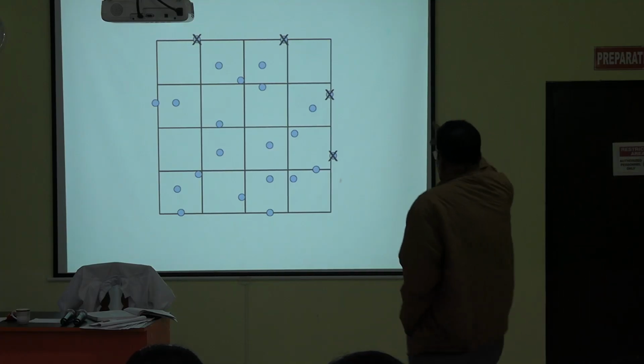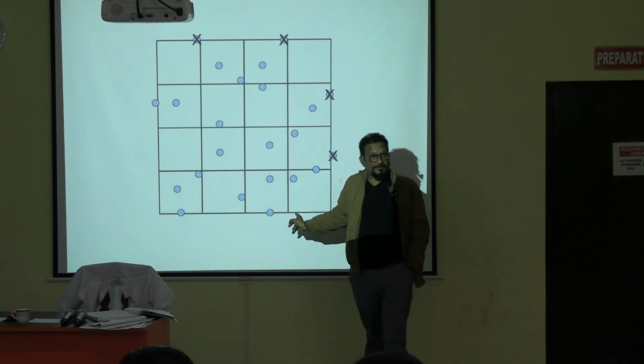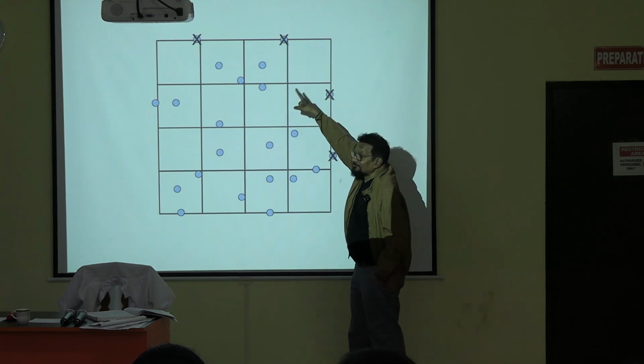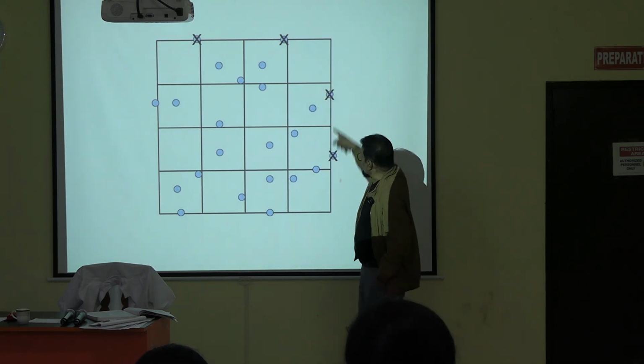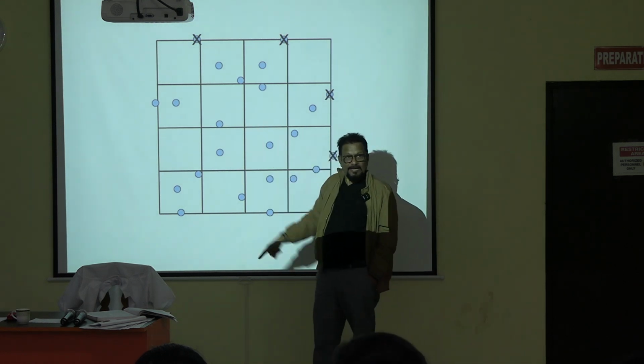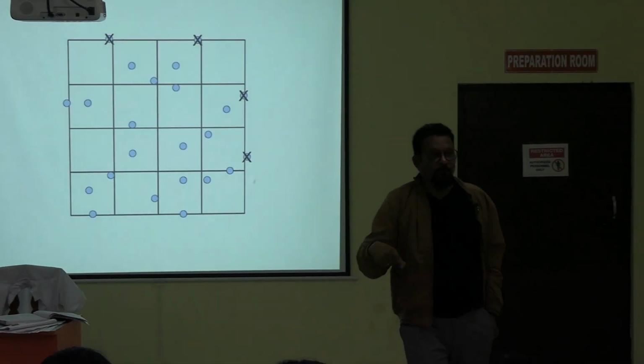You know this area. This area is known to you, isn't it? Large square or small square? This is the small square. This is the large square. This is 1, 1, 1, 1. All sides are 1. That side is already told. 1 into 0.1.